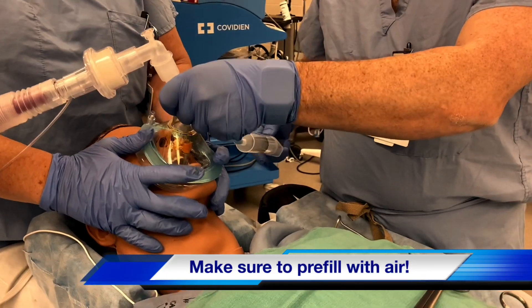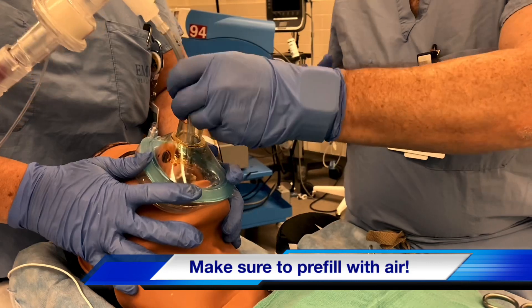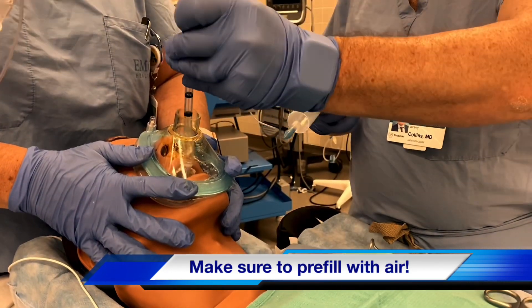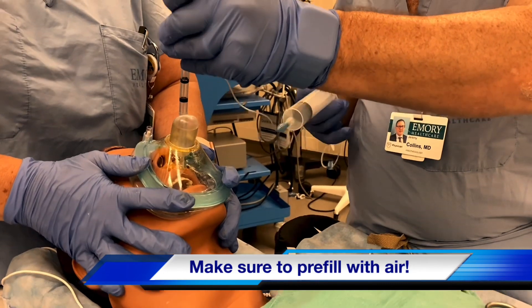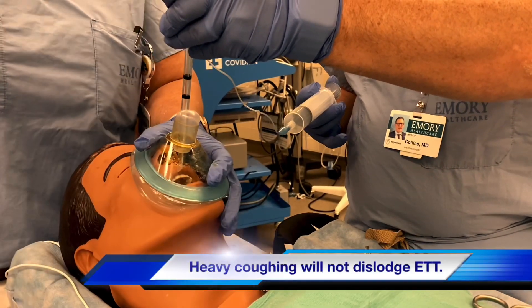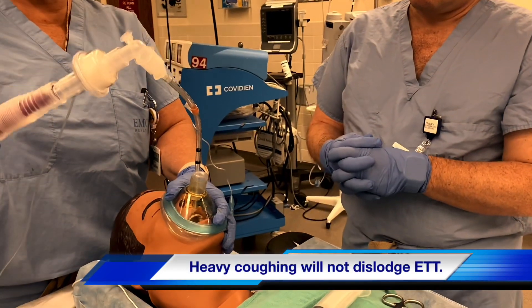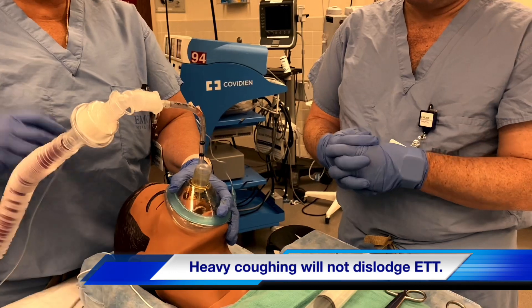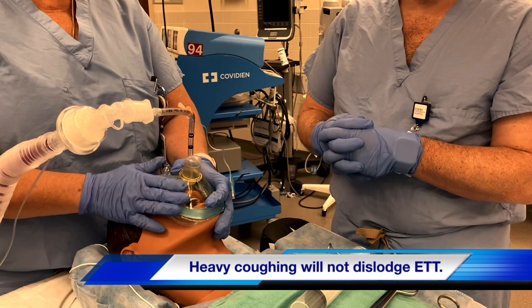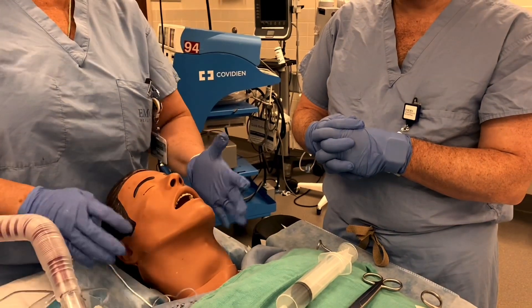As the patient is ready to extubate, deflate the cuff, pull the tube up, and then once you start to get right past the teeth, inflate the cuff with all that air you put in previously. Now you have a patient that's extubated, but you're still sealed, holding on, connected to the vent, and you let your patient get the rest of the way awake until you're ready to take this off and put on a regular face mask.